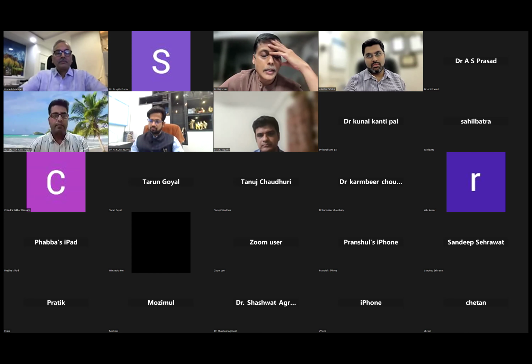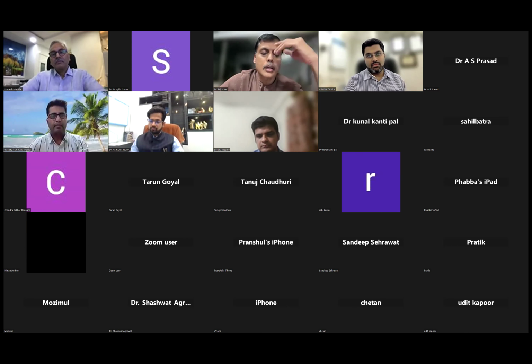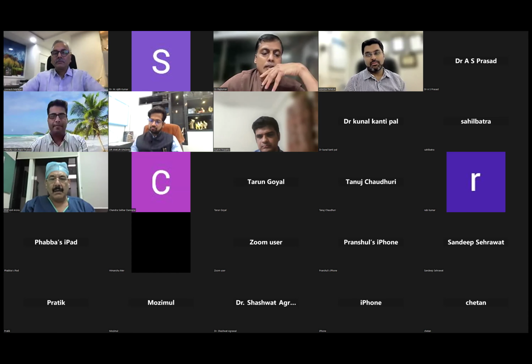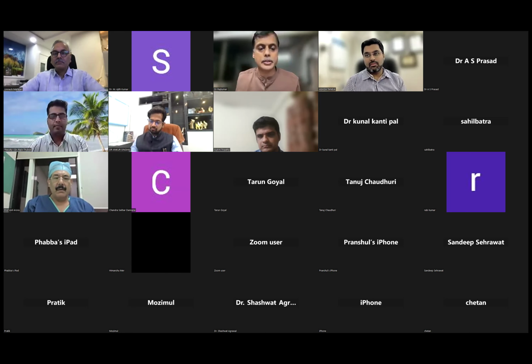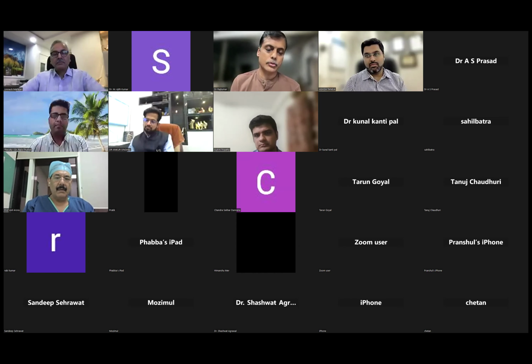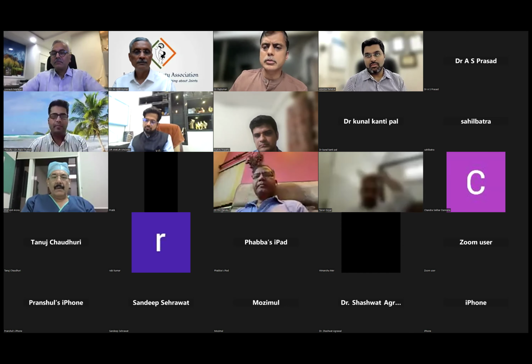Yeah, that's a good point. And also, the bone scan done at least in the first 2 years definitely has no role at all, because in the first few years there will be some increased uptake due to the surgical inflammation. Even in the radiology meetings, they suggest that bone scan doesn't have any role nowadays to differentiate, or in fact to suspect any loosening. They suggest no role for bone scan. So that will be the point. Anybody else would like to?